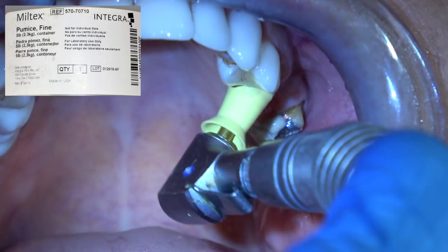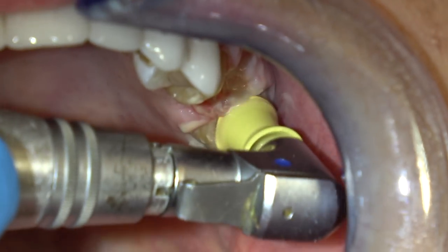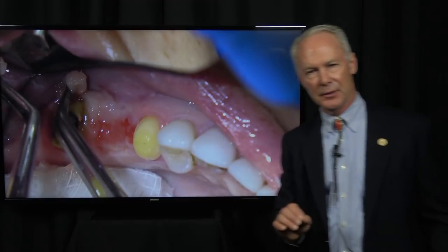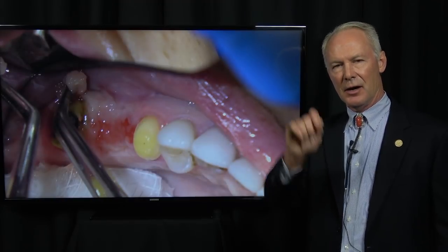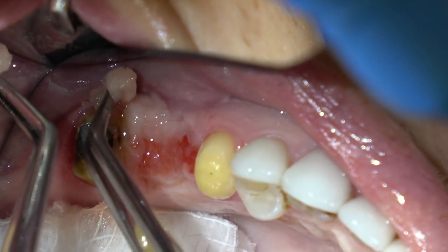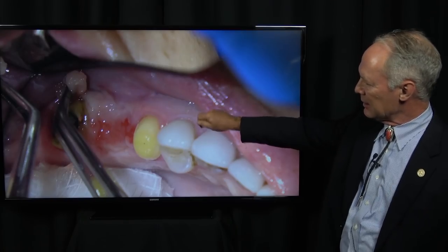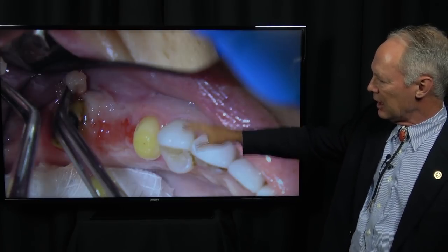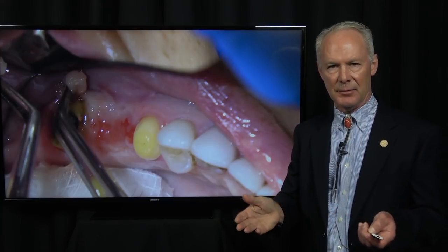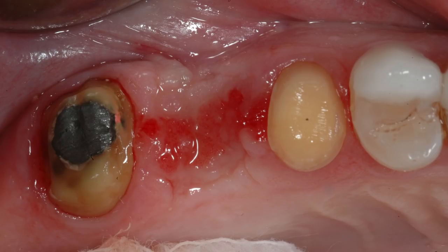I pumice the preps with pumice and water on a prophy cup after a gross removal of the excess cement. Then I put two-by-twos in the mouth and I'm scrubbing those preps with isopropyl alcohol on a cotton ball held by tweezers — a large cotton ball — scrubbing because there are areas the pumice and prophy cup can't get to. Be sure to put two-by-twos in the mouth. Then rinse that off.